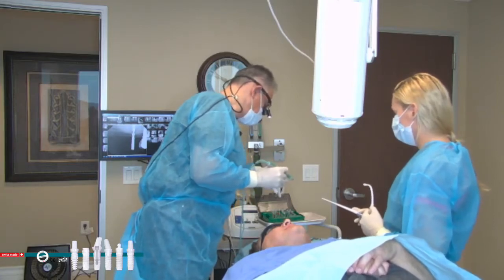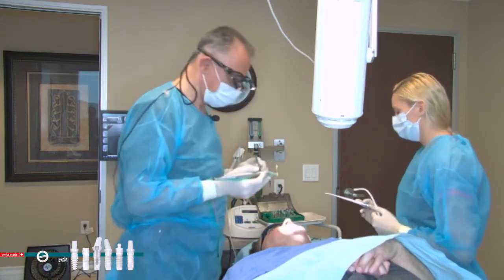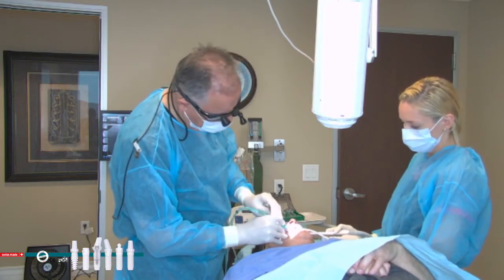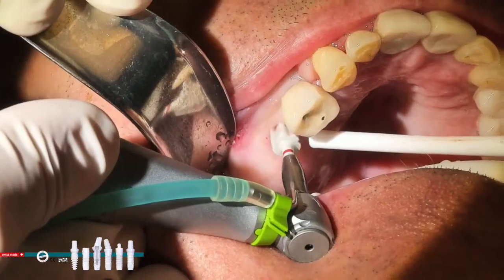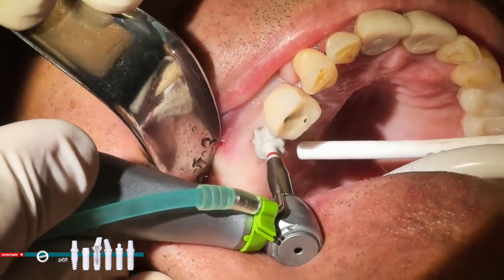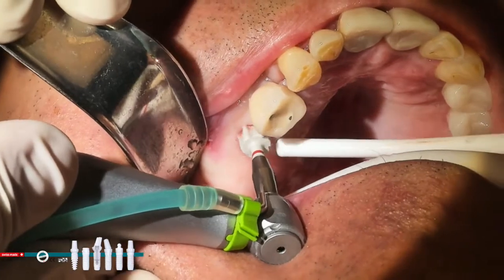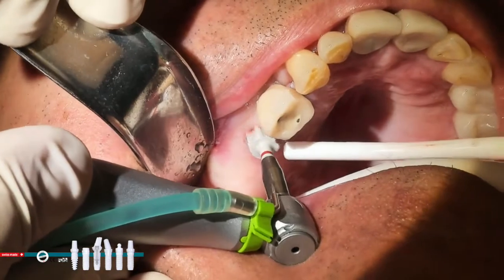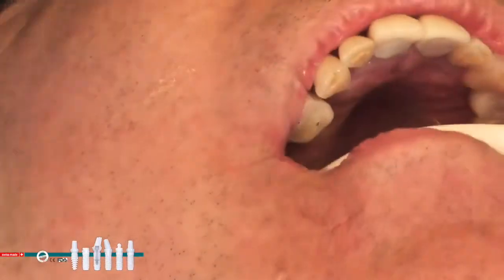With the Z Systems drill kit, it's very easy. You just follow the L shape for the 4 millimeter. Open. Because it's flapless, you take the countersink into the osteotomy deeper than what you would do when you flap the gum tissue. So you're making room for the collar of the implant? Exactly. So you're just expanding that cortical plate out, flaring it out a little. Yes, exactly. Right on.